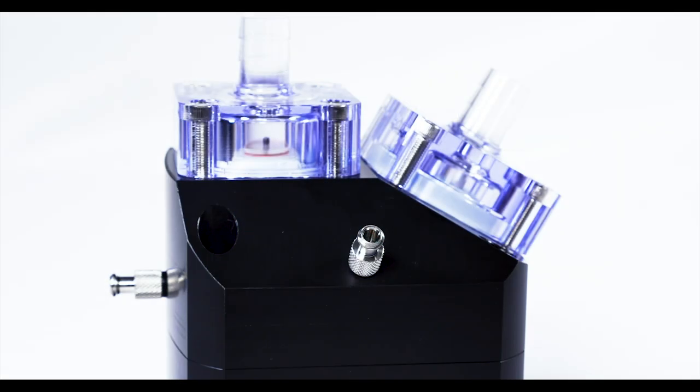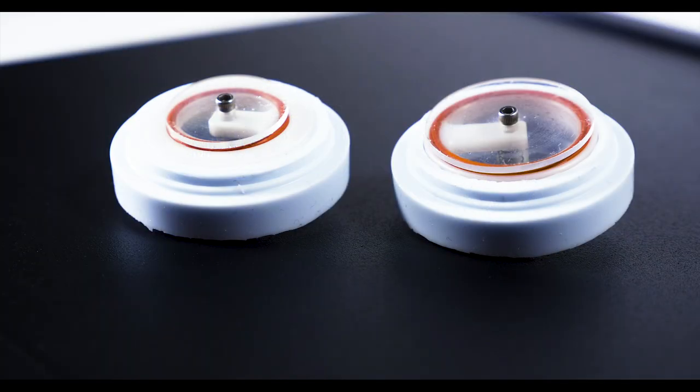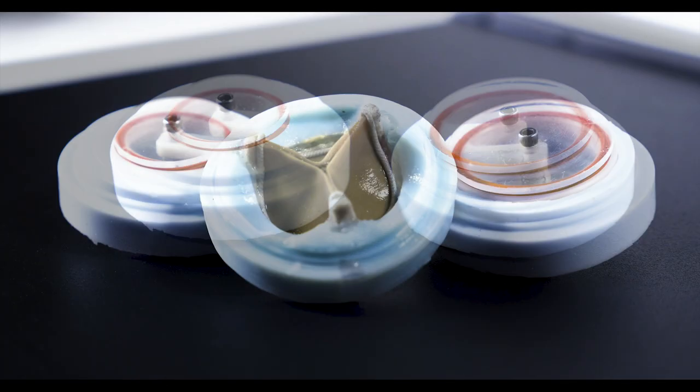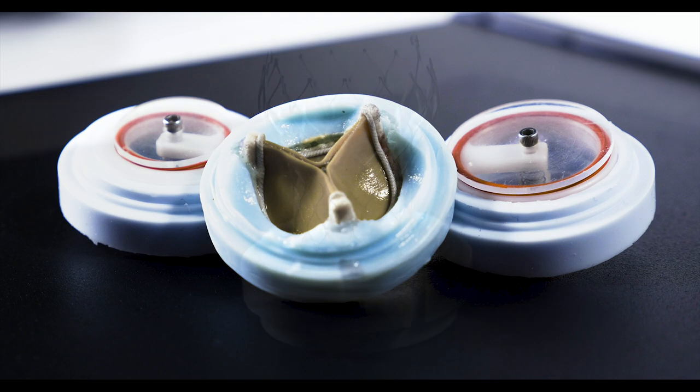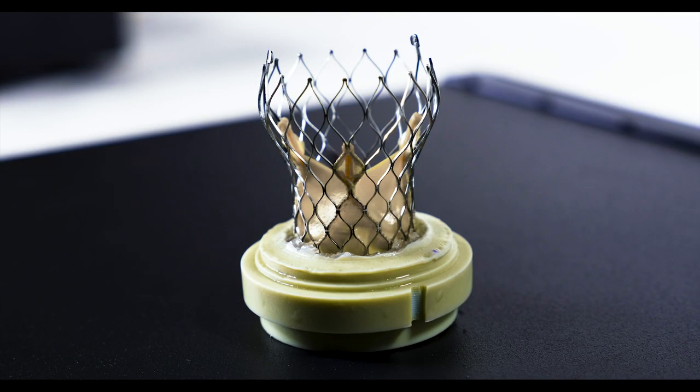Vivitro spring-loaded disc valves come standard with the system. They have a very small closing volume and almost no leakage volume. Most commercially available valves fit in the system using Vivitro standard valve mounting gasket.